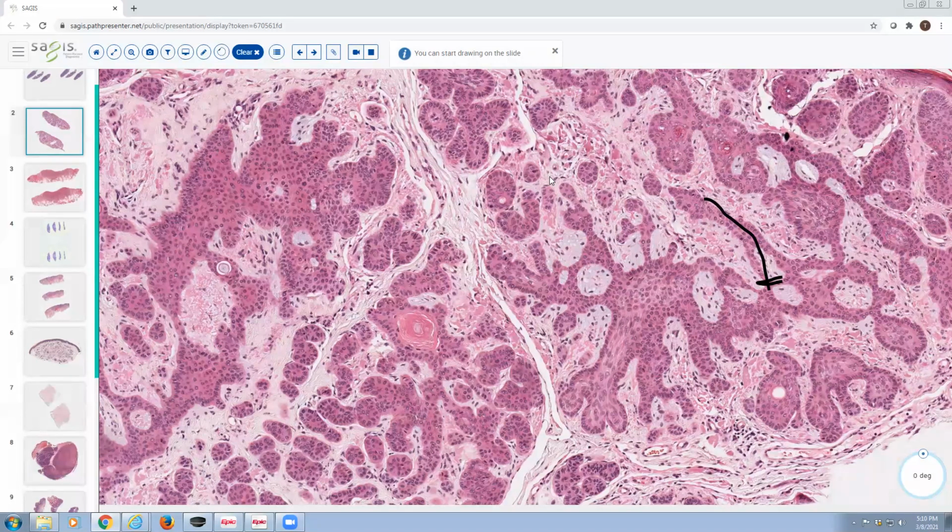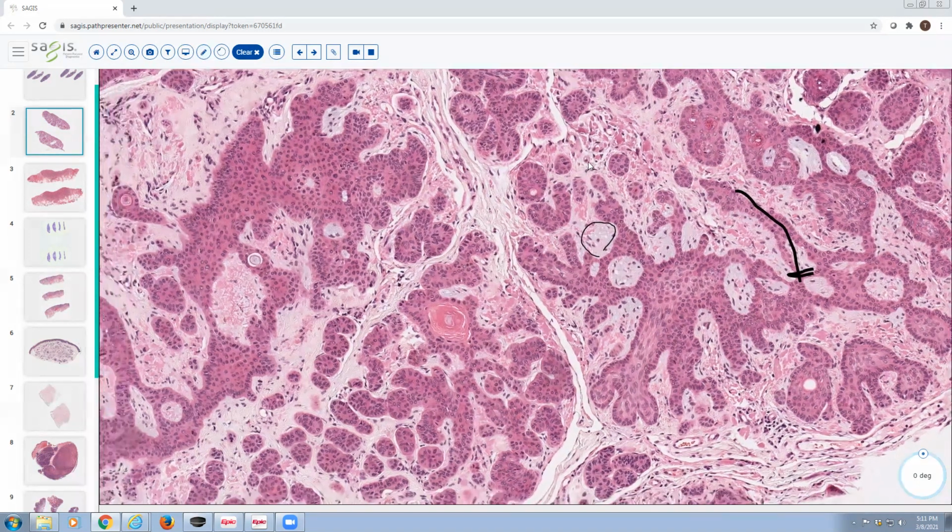And in basal cell carcinoma, like we saw in the first example, the stroma is fibromyxoid. So not super dense with respect to cellularity. So kind of a lower cellularity. And then notice here that there's this myxoid appearance to the stroma, that blue-gray color. That's that fibromyxoid stroma that's typical of a basal cell carcinoma.